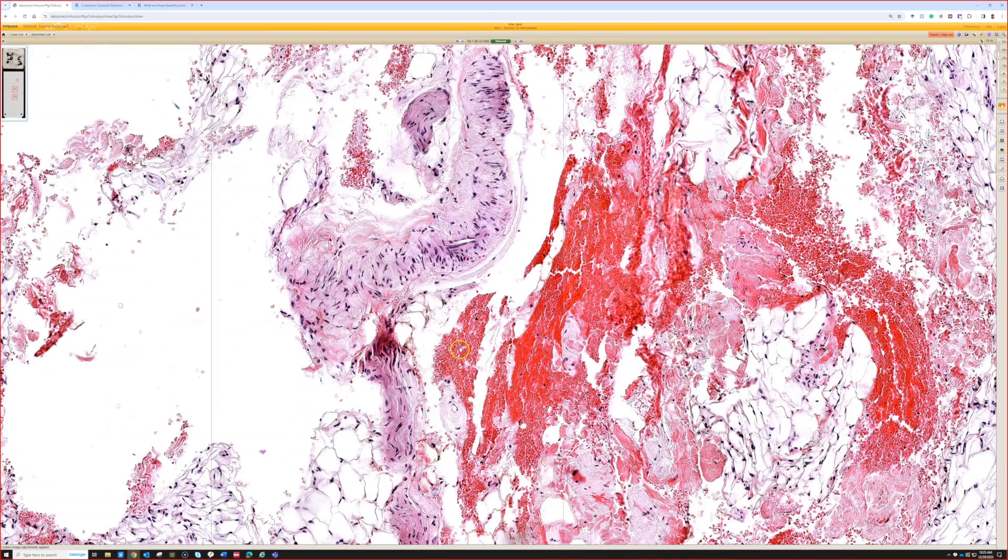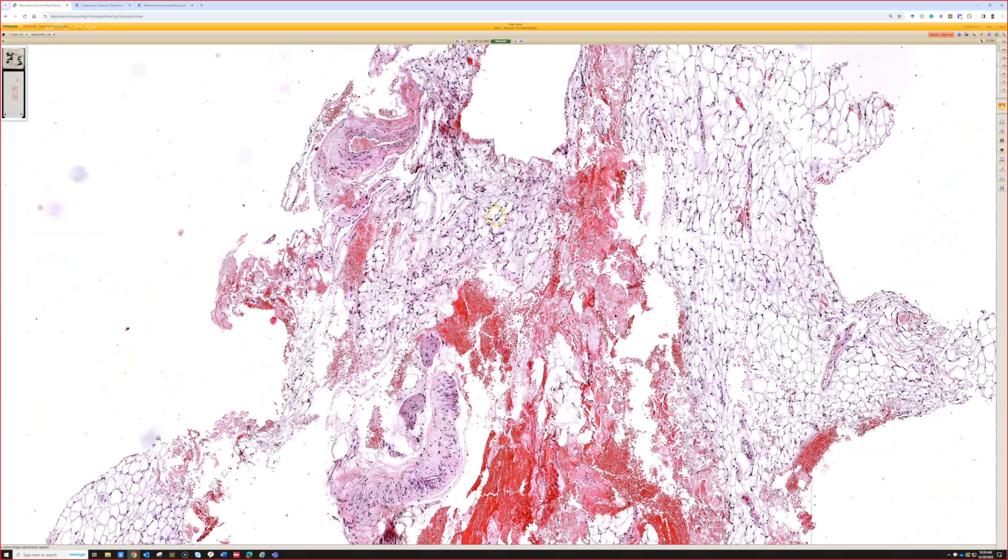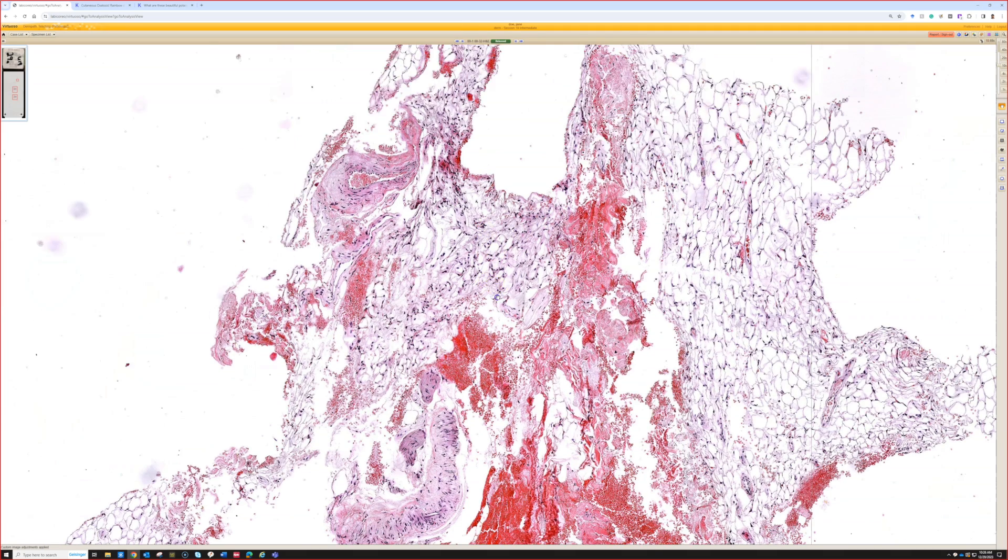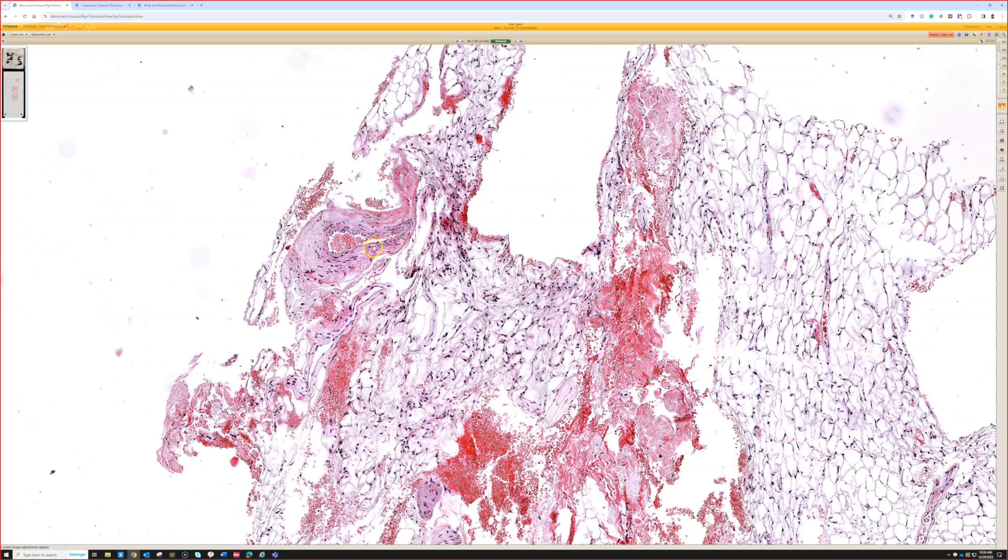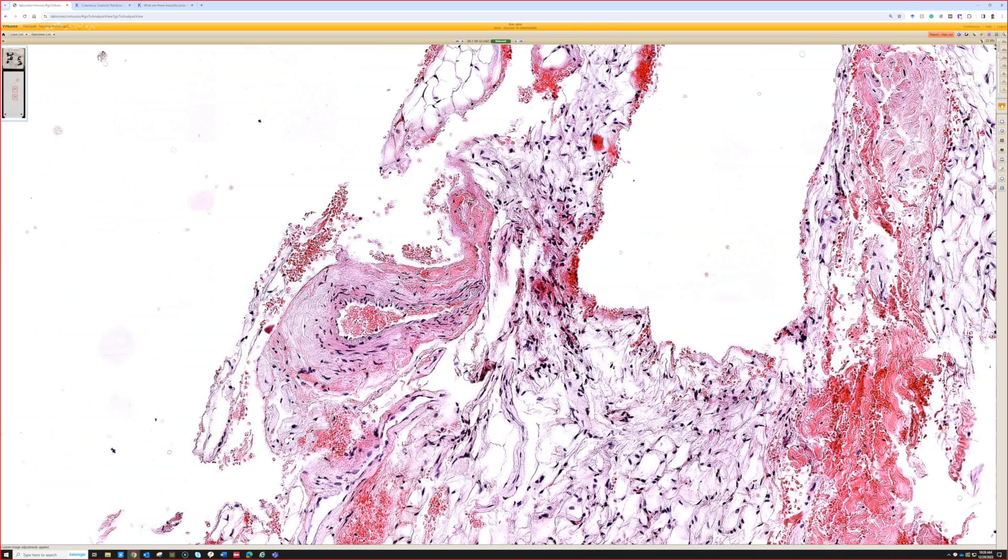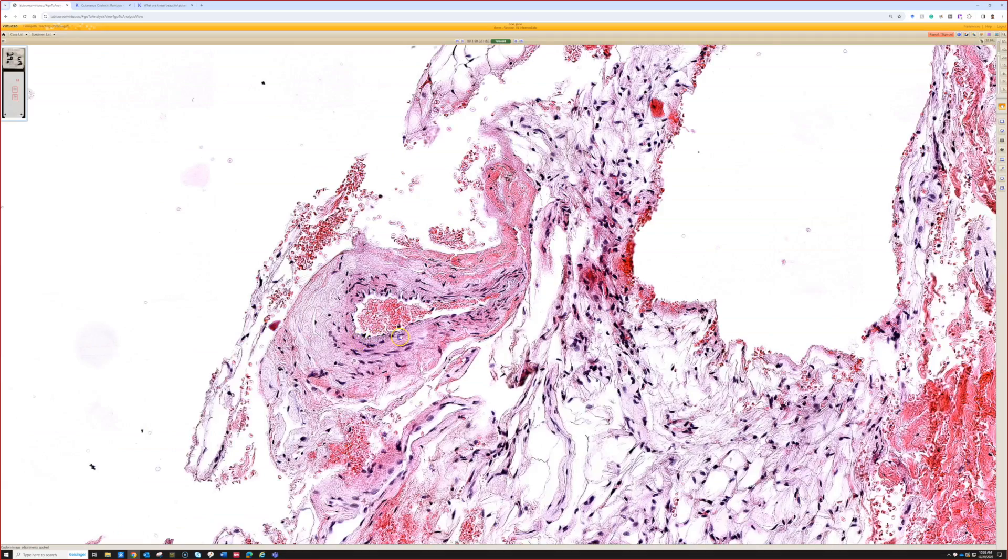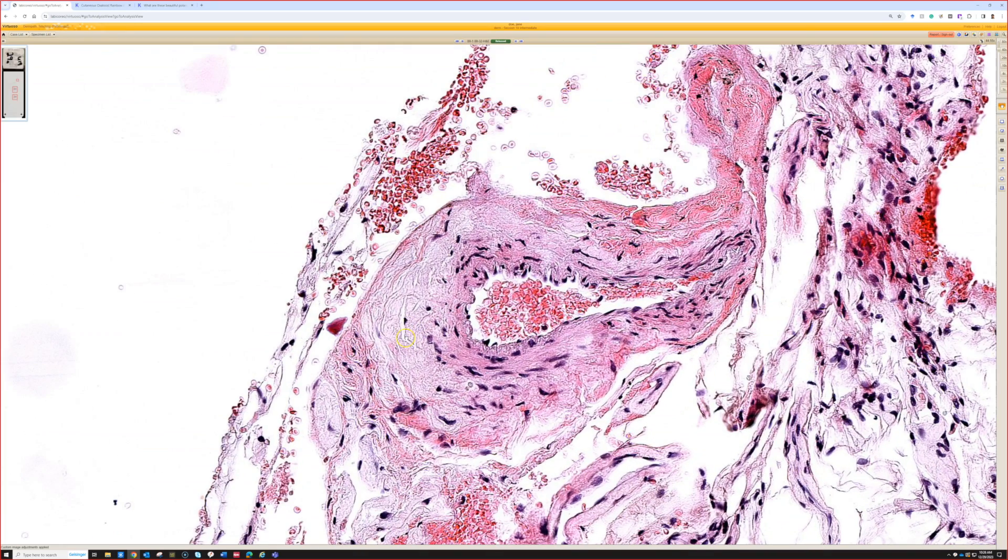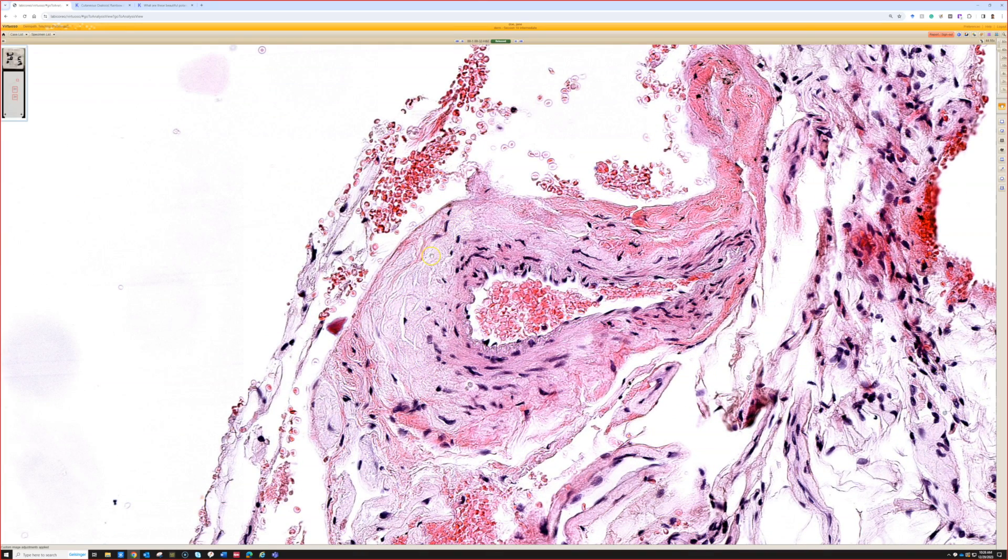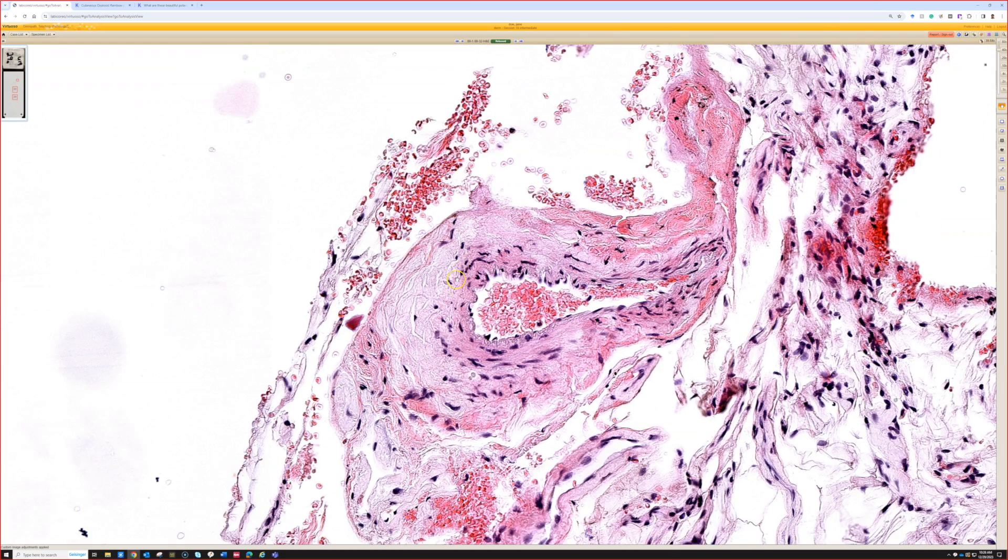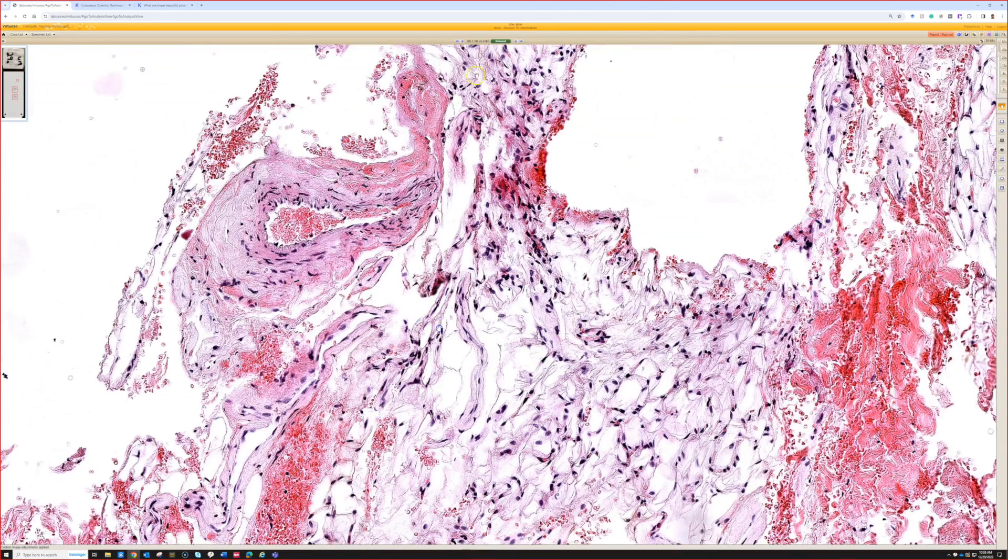When we get these specimens, we usually routinely do a thioflavin T stain. Some people do a Congo red stain. It depends on what works best in your lab, what you have access to. That right there is looking pretty suspicious. There's cracks and pale pink stuff that's kind of homogenous in the wall of the vessel. That looks suspicious for amyloid to me.